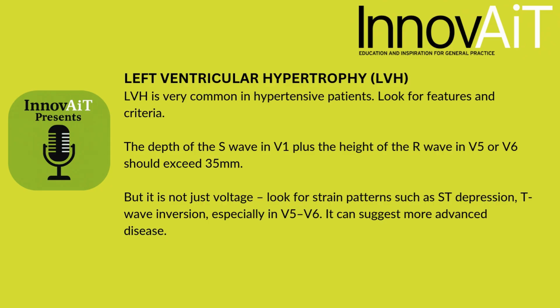So, there you are. Some of the most important ECG abnormalities in general practice. The key is pattern recognition combined with clinical context and judgment. Not every abnormal ECG needs urgent action, but some absolutely do. Knowing the difference can save lives.